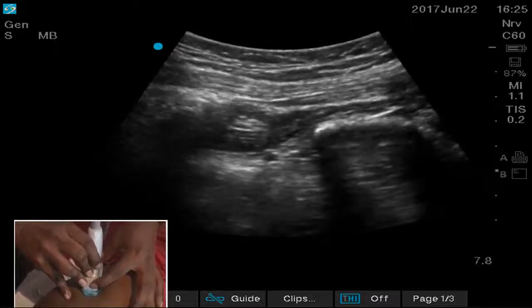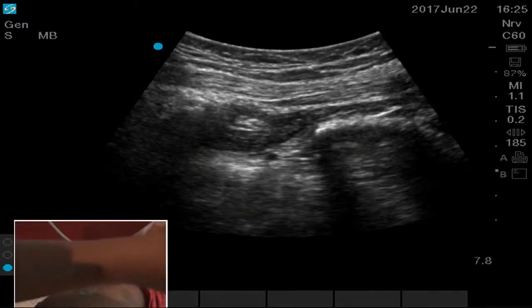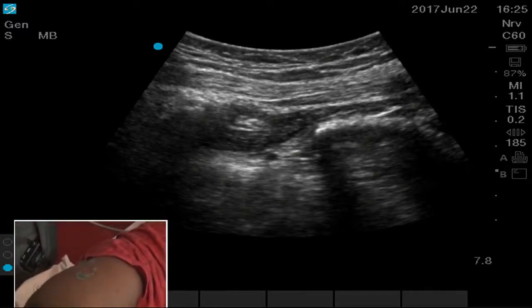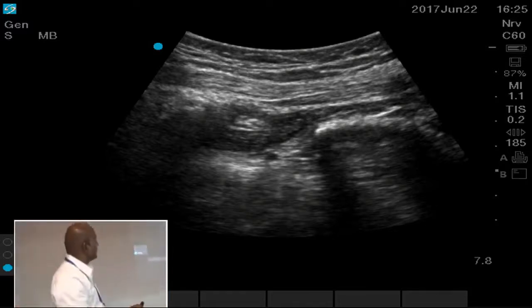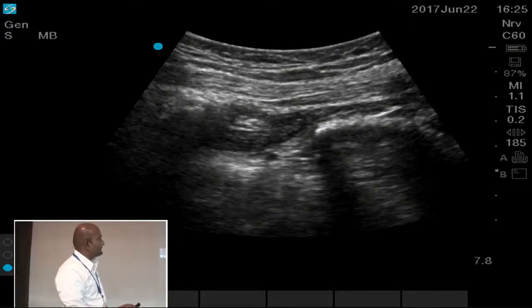Freeze it. Can you have the image? Yeah. So now this is the iliac bone which has got broken. One half is here, one half is here, and this dark muscle is the piriformis muscle, and this is the sciatic nerve. So now I will scan again to show you. There is a gap in the continuity of the iliac bone. This is nothing but the greater sciatic foramen.